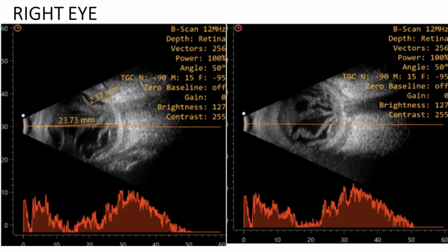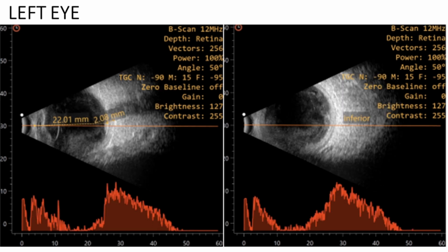So, what is the diagnosis? It's a patient with hepatic abscess, EOM restricted with conjunctival... Panophthalmitis, ma'am. So, right eye panophthalmitis. Next image. Another. The left eye image was this.